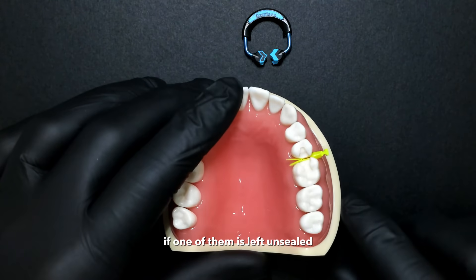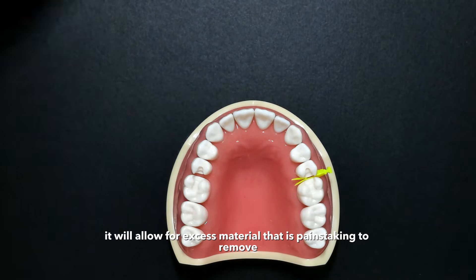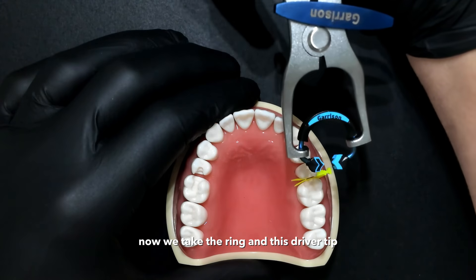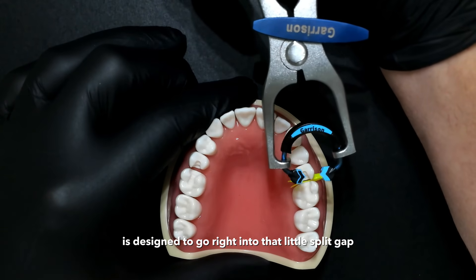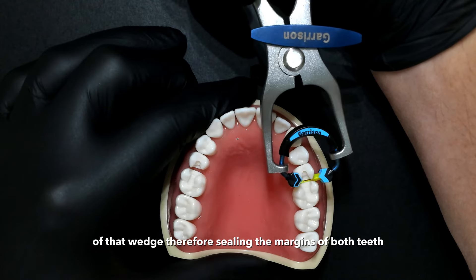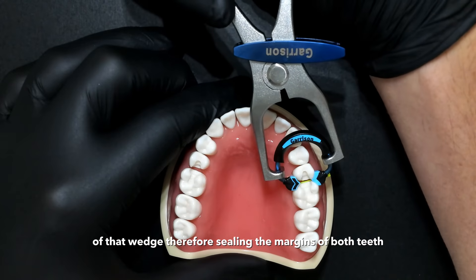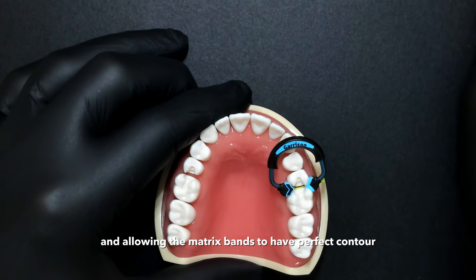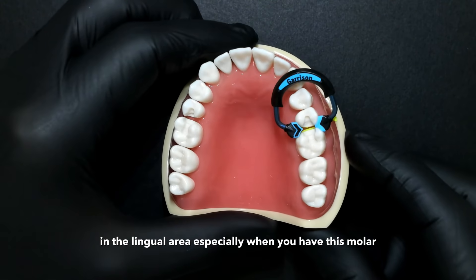If one of them is left unsealed, it will allow for excess material that is painstaking to remove. Now we take the ring, and this driver tip is designed to go right into that little split gap of that wedge.